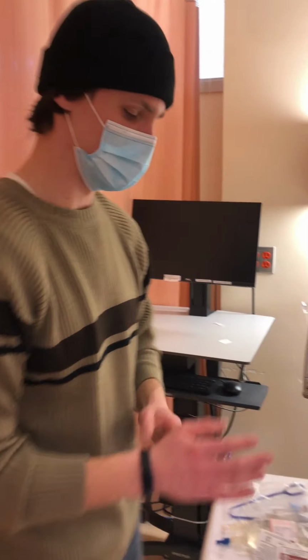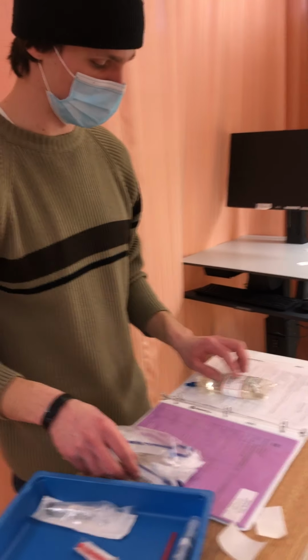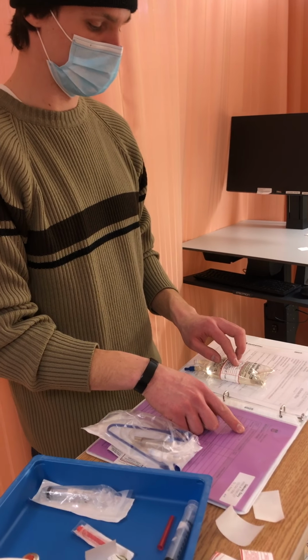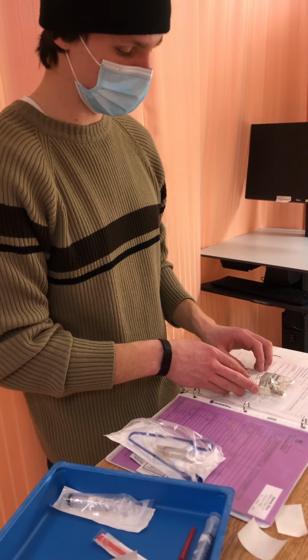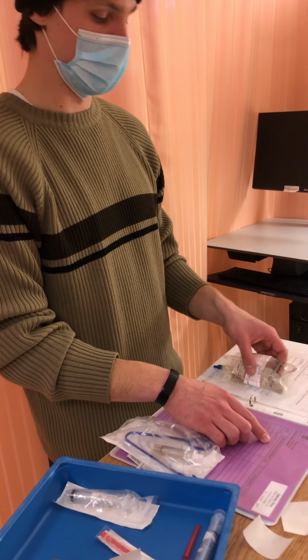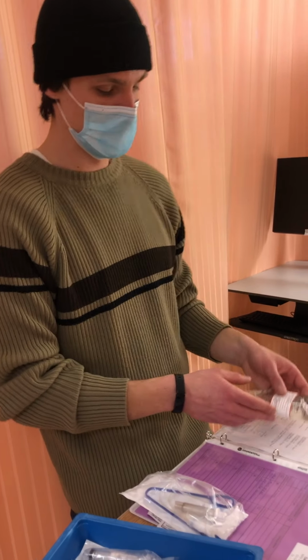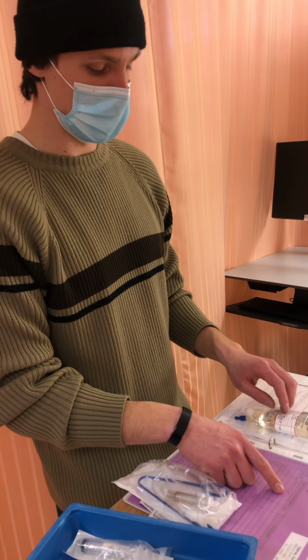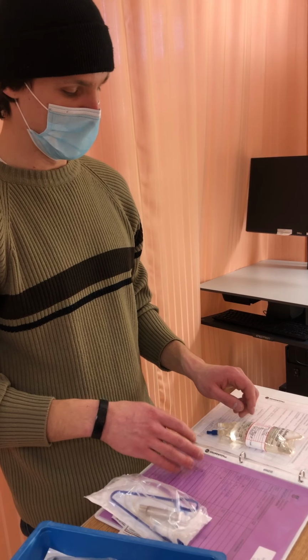I'm going to do my third check. So again, I need cloxacillin. I have cloxacillin. This is for Dory Dabney, and I just confirmed that this is Dory Dabney, so correct patient. I need 1 gram. I have 1 gram here, so correct dose. It should be given intravenously. Sorry, a route. Should be given every 6 hours. Hasn't been given yet today, and it's scheduled for now, so correct time and frequency.